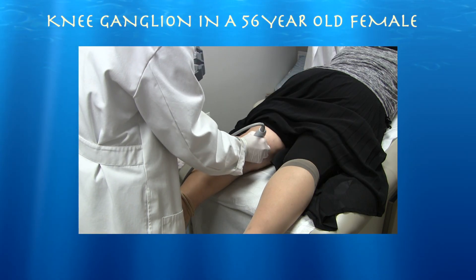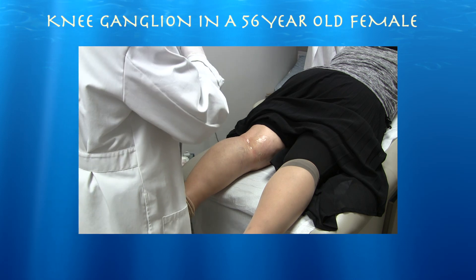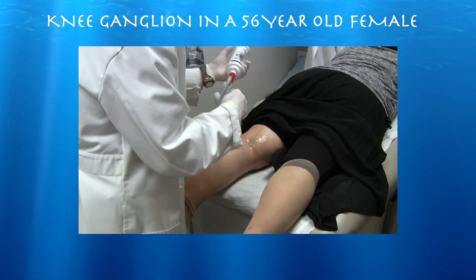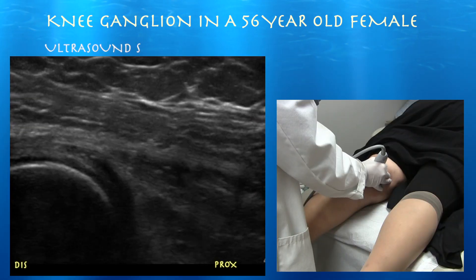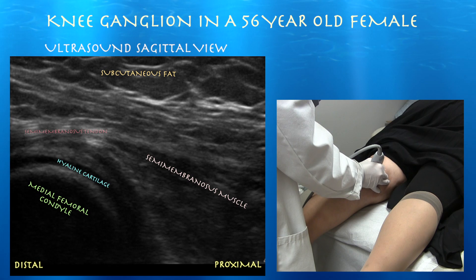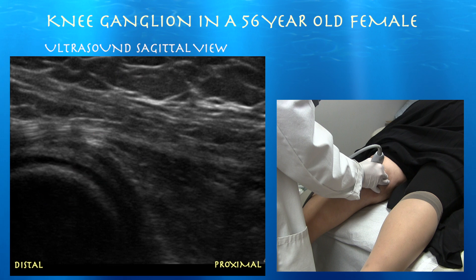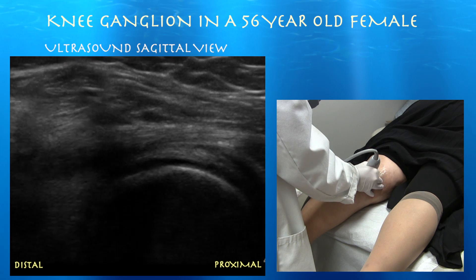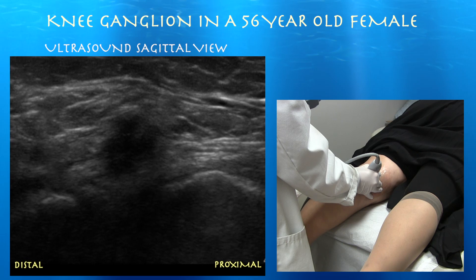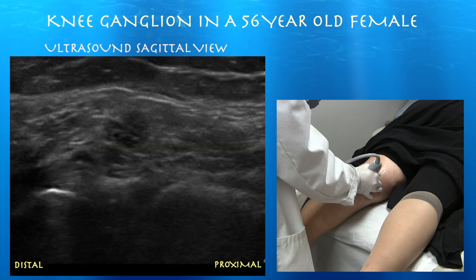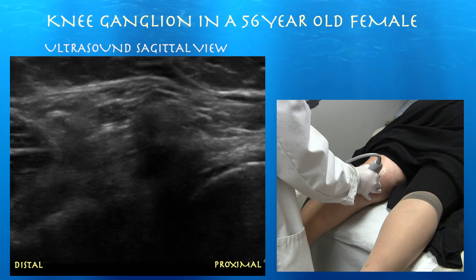She's got a nice little crease here which probably causes some anisotropy and artifact, so I'm going to try to be a little more generous on my gel. You have the semimembranosus muscle on the bottom of the screen, and here we can appreciate the semimembranosus muscle transitioning to a really thick tendon right above the medial femoral condyle. Now going distal — here is that ganglion cyst, somewhat inconspicuous as it kind of blends in with the surrounding subcutaneous fat.